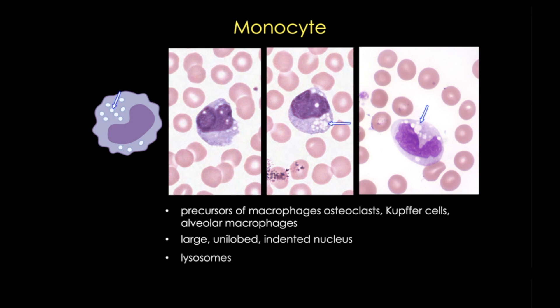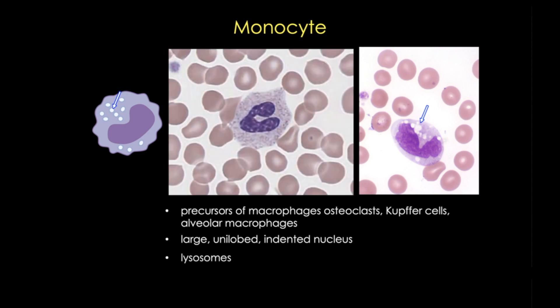Monocyte cytoplasm contains many lysosomes, which are usually white but can sometimes be a very pale blue — they sometimes look like bubbles and can be mistaken for granules, but they are usually larger and much whiter. Remember that lysosomes and granules both contain enzymes that allow neutrophils and monocytes to perform the respiratory burst. Sometimes people confuse monocytes with band-form neutrophils, but band-form neutrophils are typically thinner, with neutrophilic granules that are bluer or more purple and smaller than lysosomes. Also remember that monocytes are typically the biggest white blood cells.